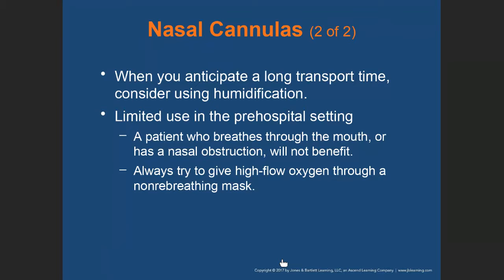Because if you have a humidifier on your portable cylinder, your cylinder must be in an upright position. And that is not an easy task in a chaotic setting in the field, right? So we wait until the patient is inside of the unit.